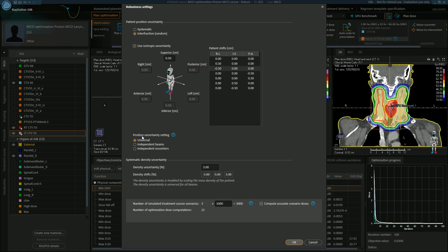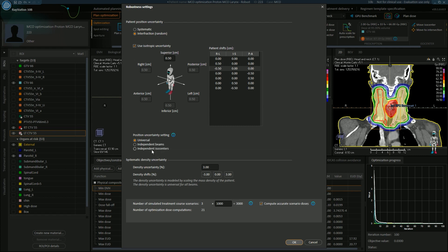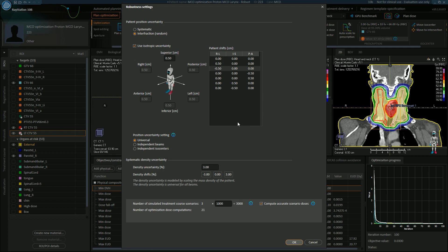We then decide the position uncertainty setting — is it universal, which is what I've selected for this case, applied to all beams universally? Or is it for an independent beam or an independent isocenter? These are options we would look at if we were planning a case with junctions. We can then define the density uncertainty, which is systematic because it is the same every single day. We can see the number of simulated treatment course scenarios and the number of optimization dose computations, and we can also select to compute our scenarios using the Monte Carlo dose engine.